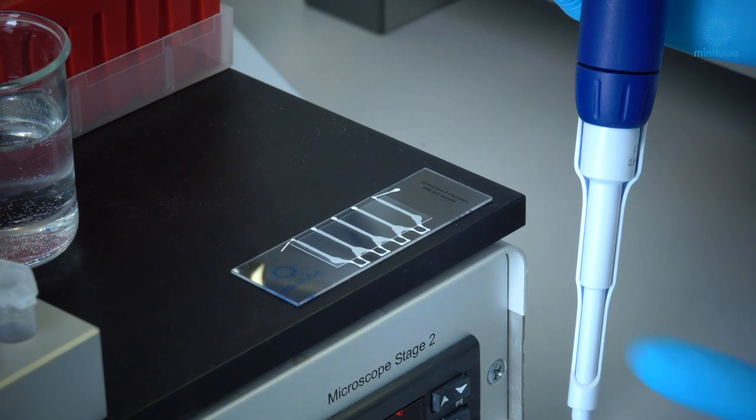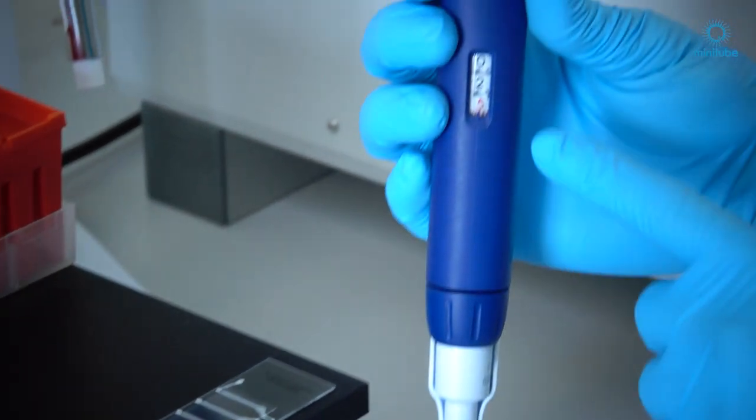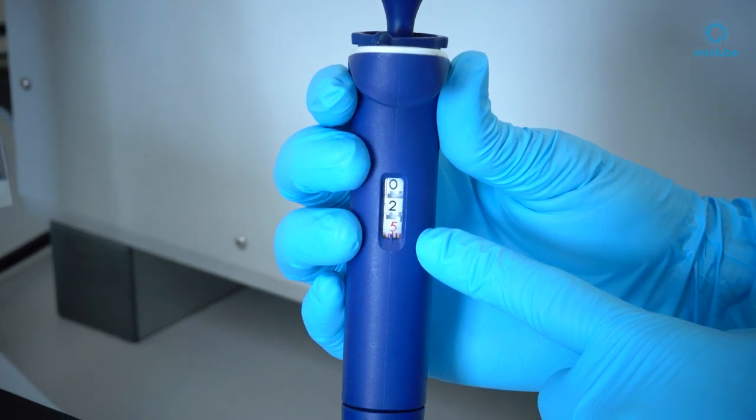If you use a mini tube counting chamber, you have a filling volume of 2.5 microliters.